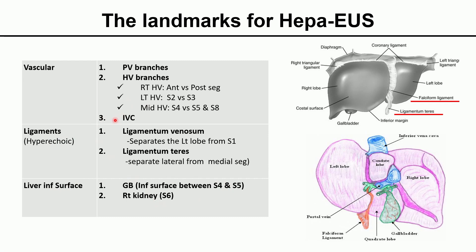Vascular structures include the portal vein, hepatic vein, and inferior vena cava. Ligaments are the ligamentum venosum and ligamentum teres. Ligamentum venosum separates the left lobe from S1. Ligamentum teres separates the lateral from the medial segment.